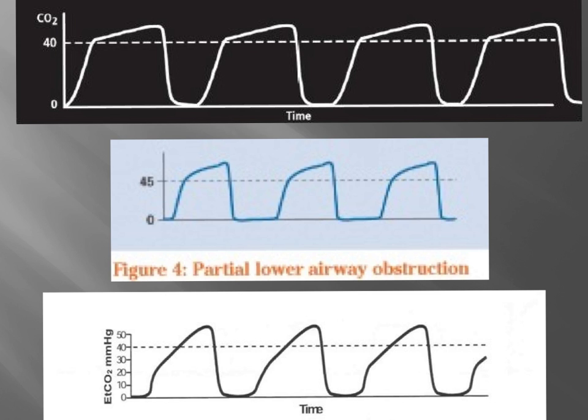And we can see here that the waveform is relatively upright to begin with, but then starts having this broad, pronounced sloping. Well, if we think about that lung again, this area right here is where we start getting into that deeper part of the lung, where we're richer in carbon dioxide, and we start beginning that alveolar washout.